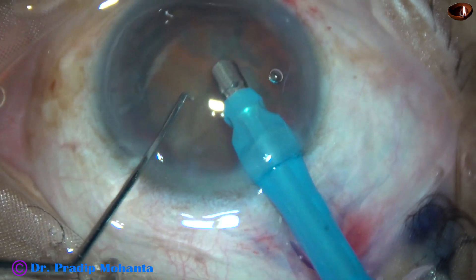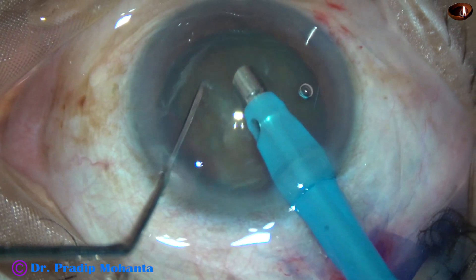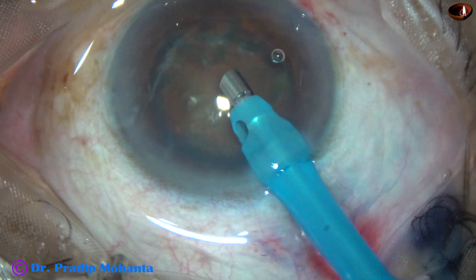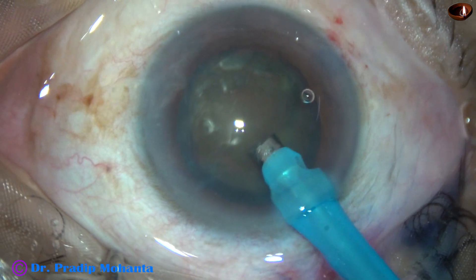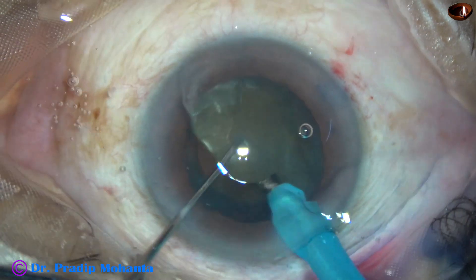It goes beveled down. Some superficial lens matter is removed. And now the handpiece is turned to make the bevel up — to make the bevel of the tip of the phaco needle up. And now watch: submarine chop.